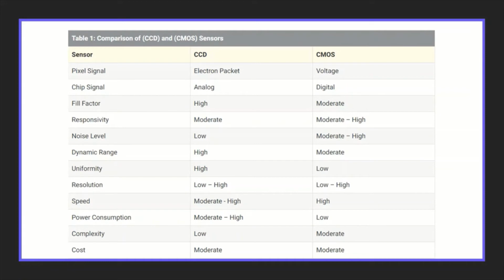Despite improvement in CMOS, CCD still maintains an advantage, albeit a shrinking one, for applications that need the highest image quality in terms of uniformity, MTF, dynamic range, electronic shutter capability, and image stability. The caveat being, of course, that they must be able to operate acceptably at CCD available speeds.